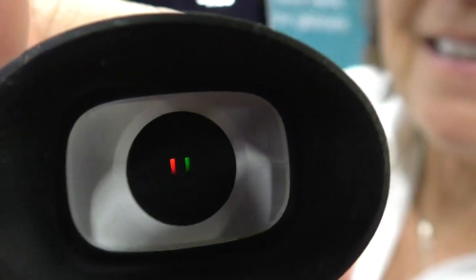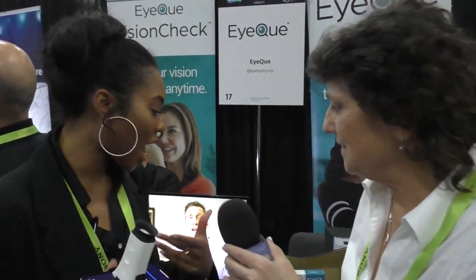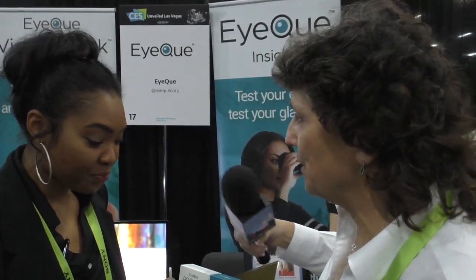Steve, can you see inside it? You can actually see the lines moving — that is really interesting. So this combined with the PD Check frames is essentially an all-at-home eye care solution. You can get glasses online without ever leaving your couch. So how much is this going to cost? It's $59.99 MSRP, but on Indiegogo you can get it for $35 right now — a little cheaper than an eye doctor visit.